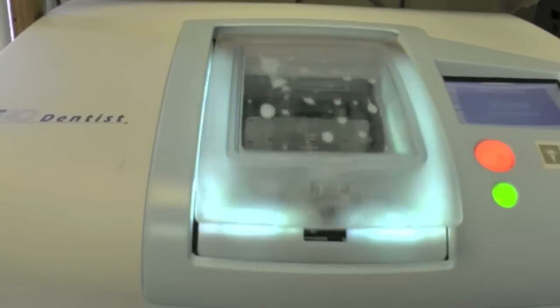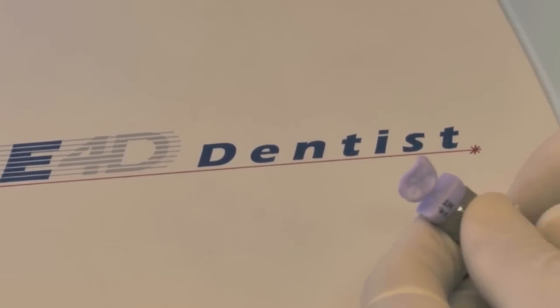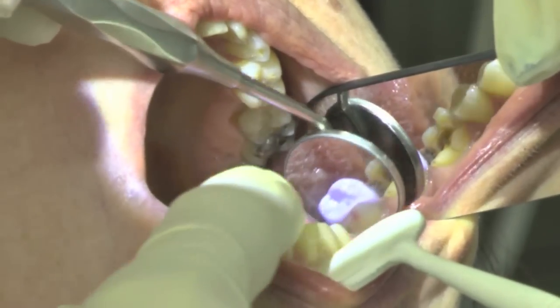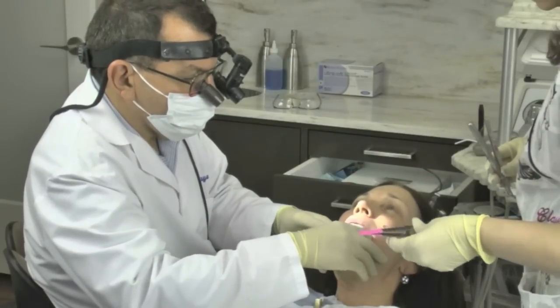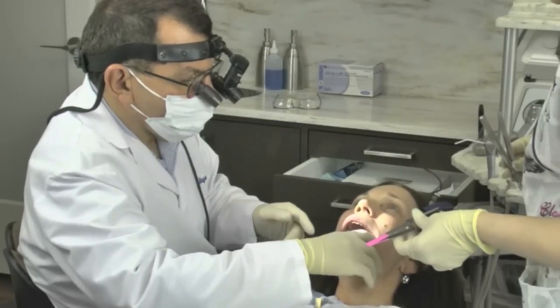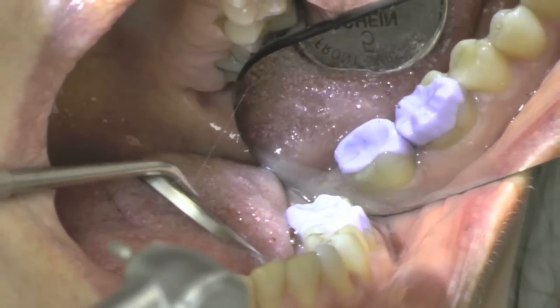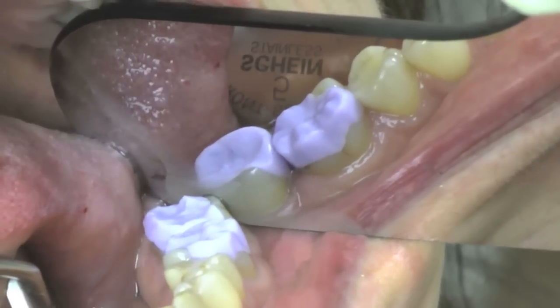So with the milling complete, we're able to inspect the restoration. We remove the sprue and we try it in the blue phase, which is much softer than our final form of the Emax. This way we can inspect the margins, contacts and occlusions and make any adjustments as necessary. The amazing thing about the E4D is that it's very rare that you have to make any adjustments. We have placed thousands of these restorations over the years, and I'm always impressed by the accuracy and precision. Once satisfied, we go ahead and stain and glaze.